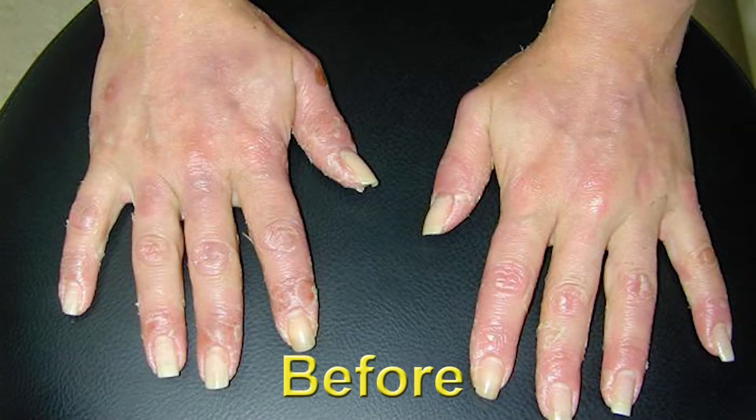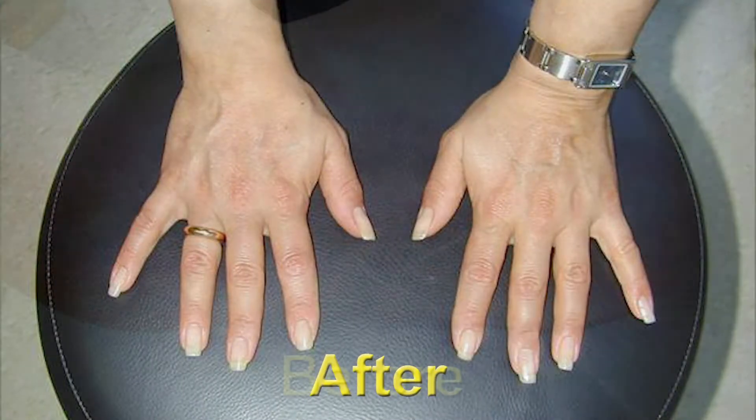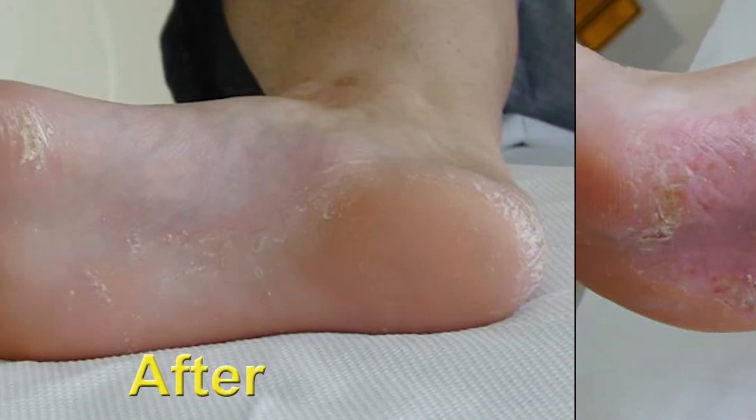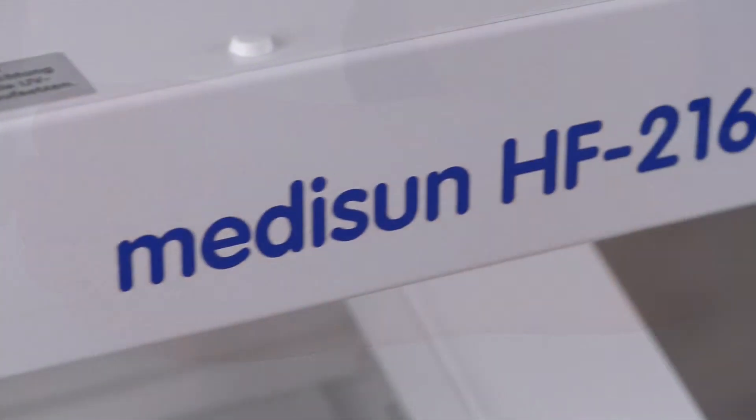The good therapy results speak for themselves. MidiSun HF216 is the professional version of our hand and feet device, especially for dermatology practices and clinics.